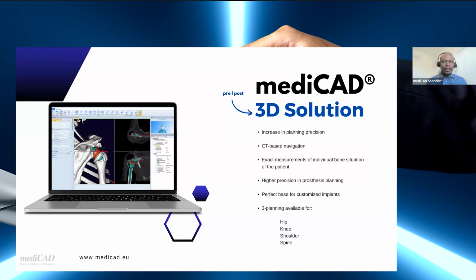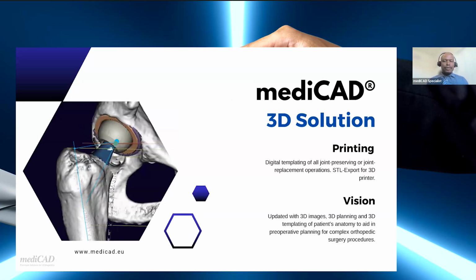It also creates a documented workflow to meet legal compliance standards. The 3D uses CT, basically of the joint, and you'll see what that looks like once I get started. The 3D solution also includes 3D printing and so forth.